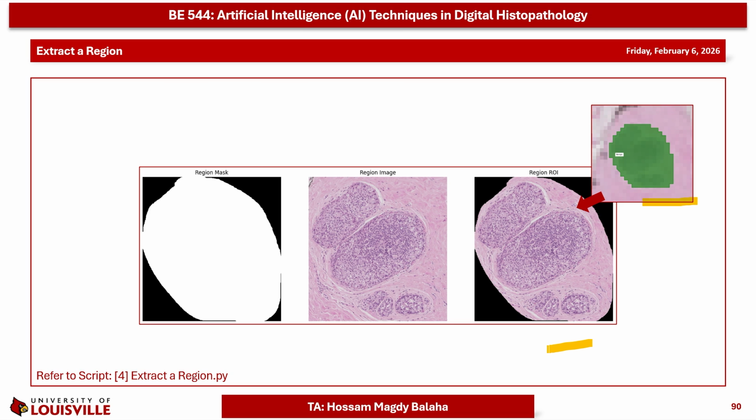After that, we went through installing the OpenSlide package in Python and recapped the BACH dataset, which contained 4 classes. And after that, we went through the demonstration of 4 scripts from reading the whole slide image and annotation until extracting a specific region at a specific index.